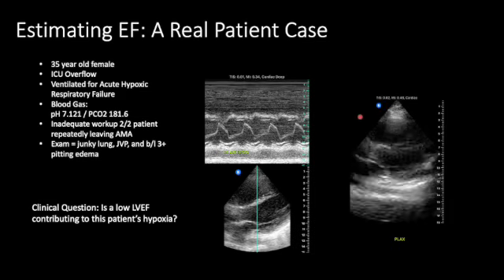But when I did an EPSS, I noticed that the anterior leaflet of the mitral valve did seem to come into pretty close contact with the interventricular septum. And so I looked at this and I said, I really don't think that there's a lot of left heart disease here. I think this is a pretty good ejection fraction on the left side. Maybe a little bit hyperdynamic. I didn't do an official measurement there of how close the walls are getting to each other.